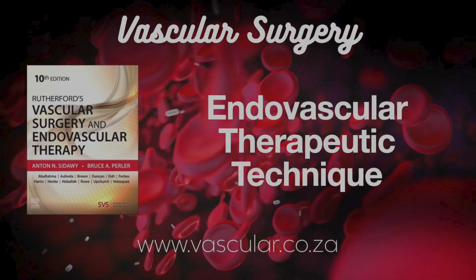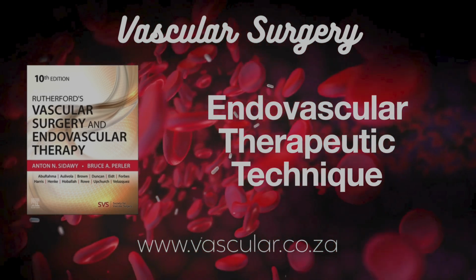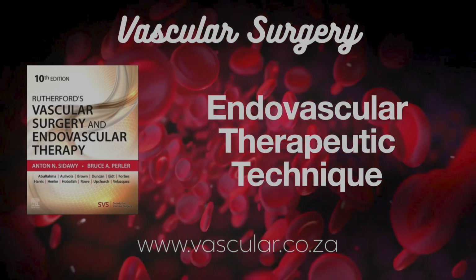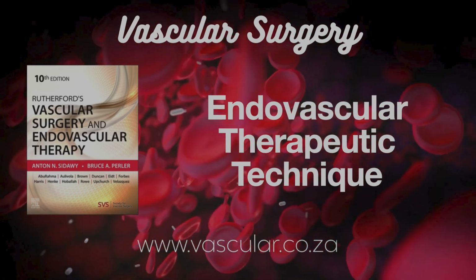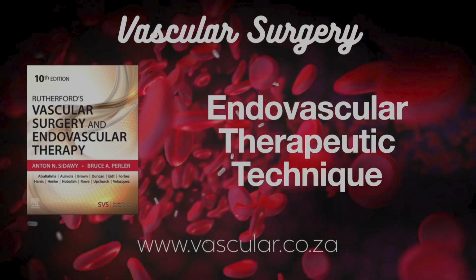Subintimal angioplasty. Going around the blockage in the wall. Exactly. Intentionally create a channel in the subintimal space. First described by Bolia. Use a hydrophilic wire loop, advance with a catheter, bypass the occlusion, then try to re-enter the true lumen distally. Often works, success around 80%, good limb salvage. Failure is usually inability to re-enter, hence re-entry devices.